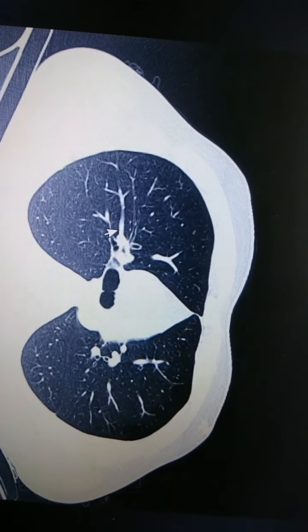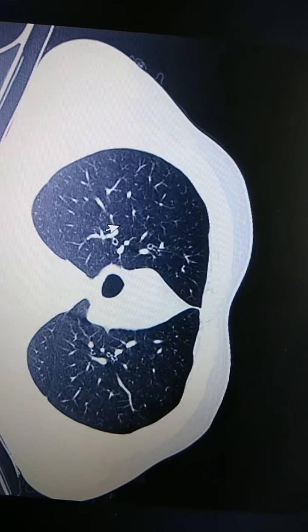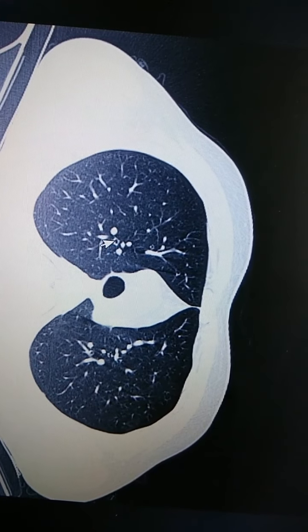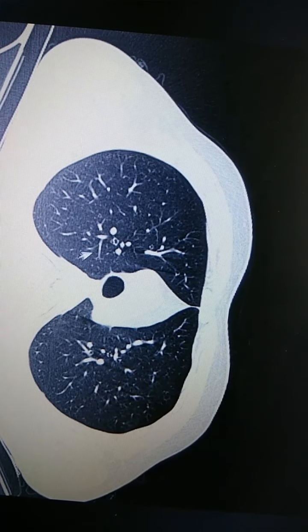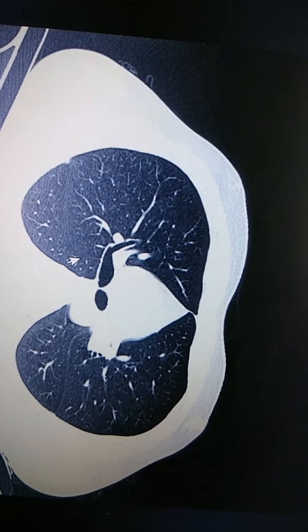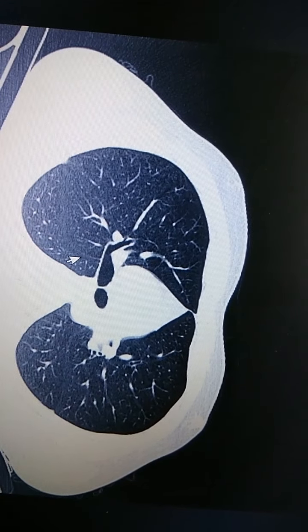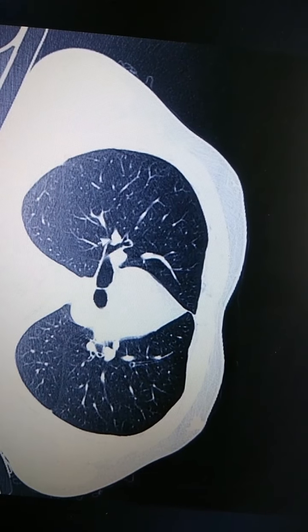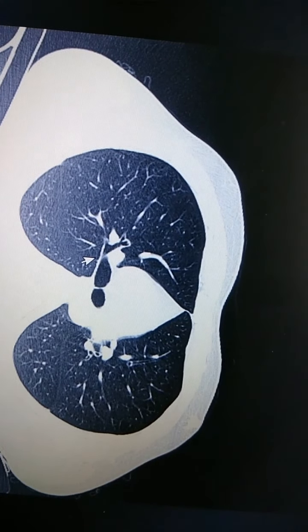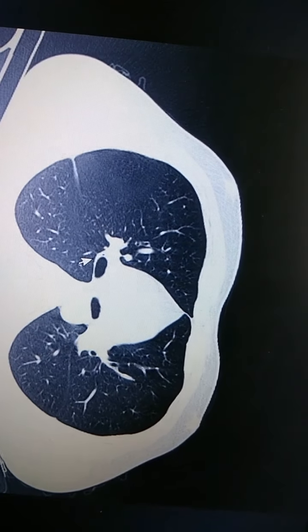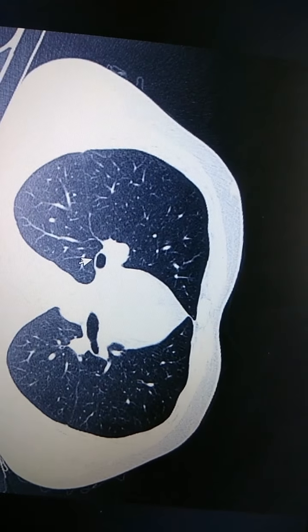We scroll upward and then back down to see the anterior and posterior segmental bronchi. This is the anterior and posterior segmental bronchi. Once the right upper lobe bronchus is given off, as we scroll down, we see the bronchus intermedius.